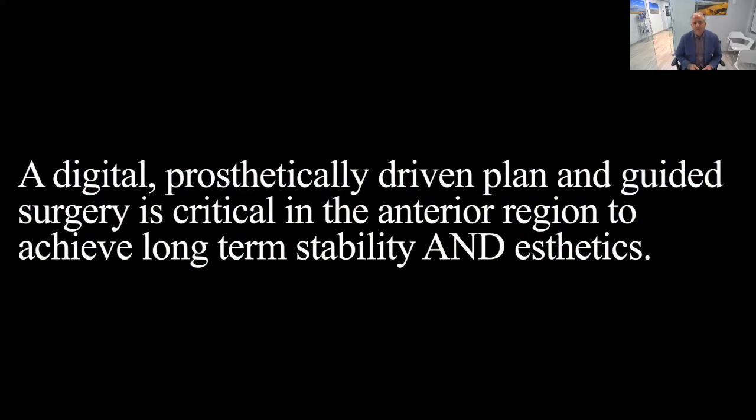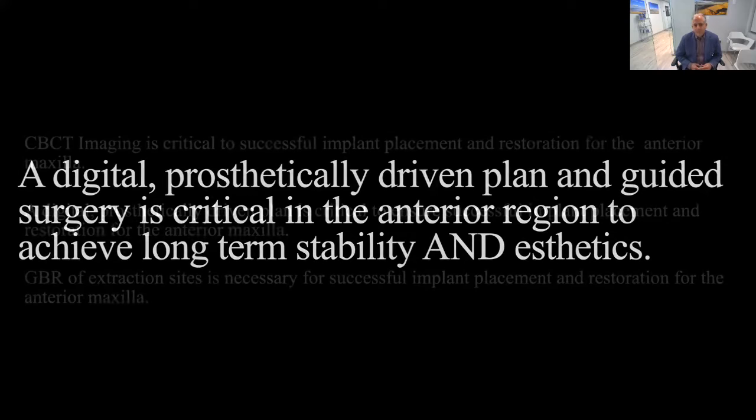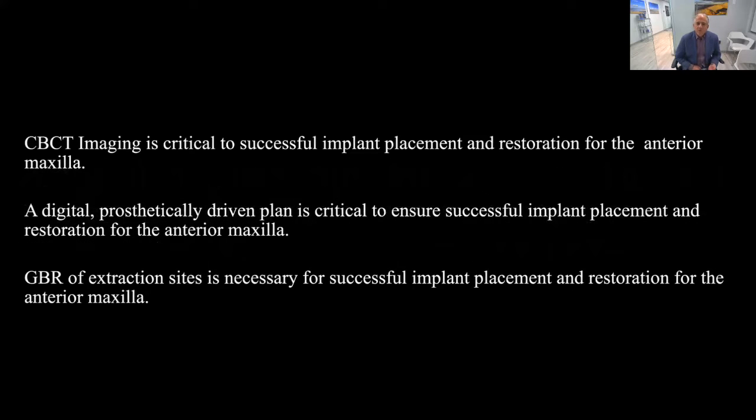So I'm going to make a statement, and the statement is a digital prosthetically driven plan and guided surgery I think is critical in the anterior region to achieve long-term stability and aesthetics. I think cone beam imaging is critical to successful implant placement and restoration for the anterior maxilla, and throughout the presentation I hope to show why I feel that way. I think a digital prosthetically driven plan is critical to ensure successful placement and restoration for the anterior maxilla.